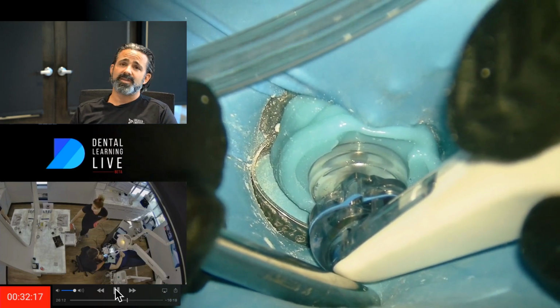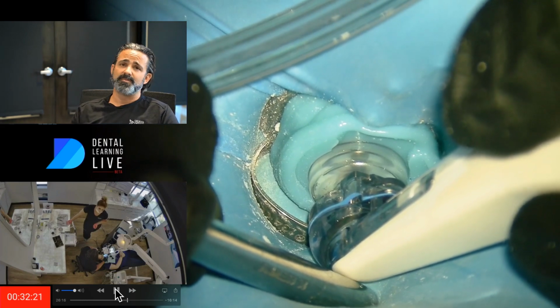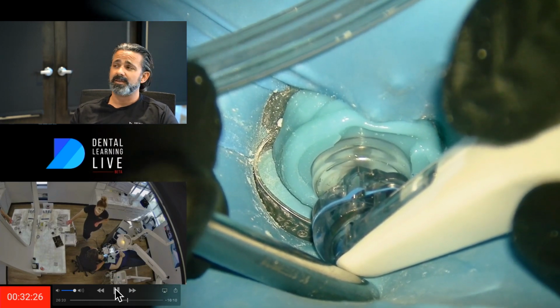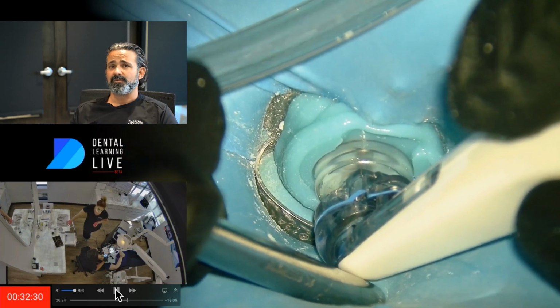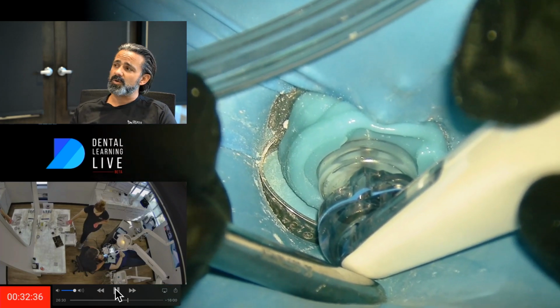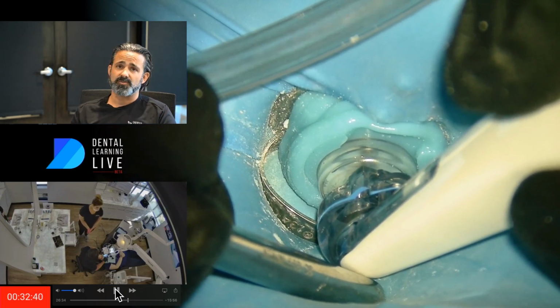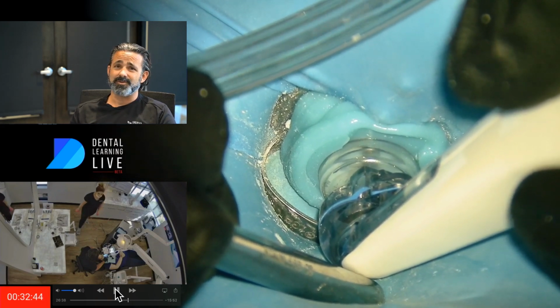If you're familiar with how the console works, you do have a case selection that you'll do based upon the type of case that you have, if it's vital or if it's necrotic. And you have a choice to extend the cycle, and roughly the retreatment's just an extended cycle. It does sync with TDO, so as you make that decision tree, that can be entered into your notes, which is quite useful for follow-up, recall, and just being accurate with your information.